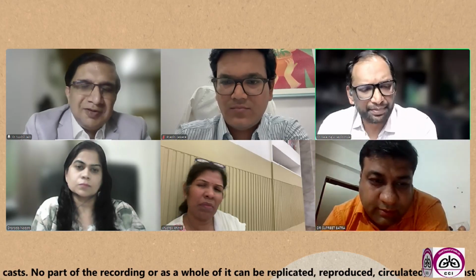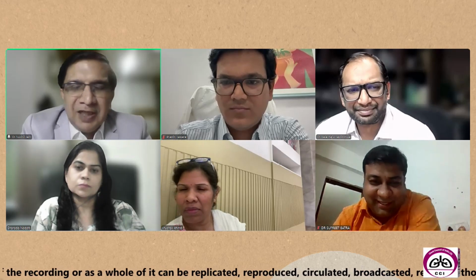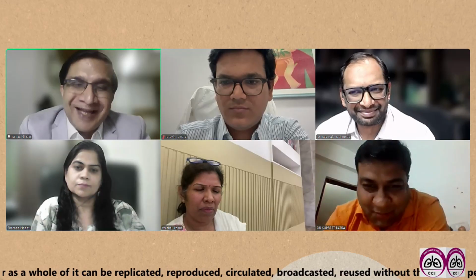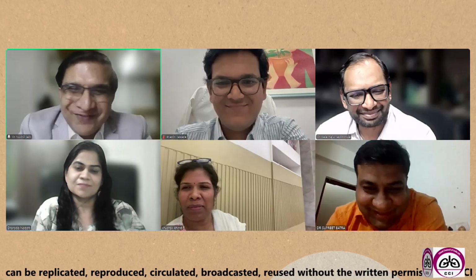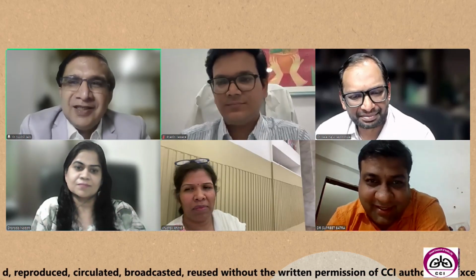Agree. Now, the problem with this is that when I started with blind TBNA, during those days we used to use 19 gauge for blind TBNA. So I have done that, and I am very comfortable with this also. So maybe that must be one of my biases. But yes, 19 gauge is no longer available, I think, and it gives a little more bloody tissue.